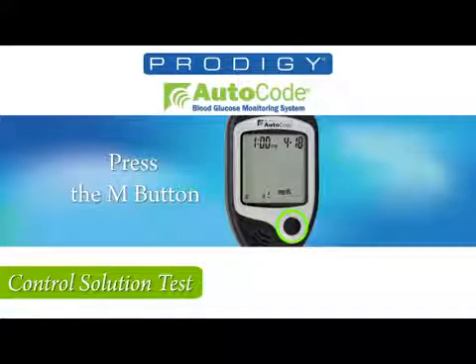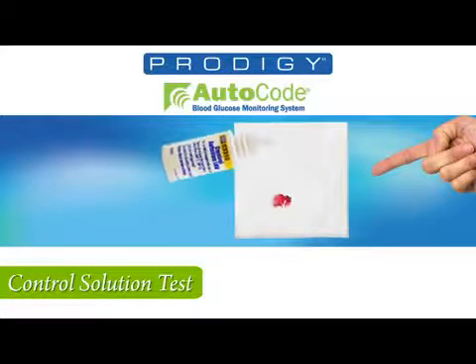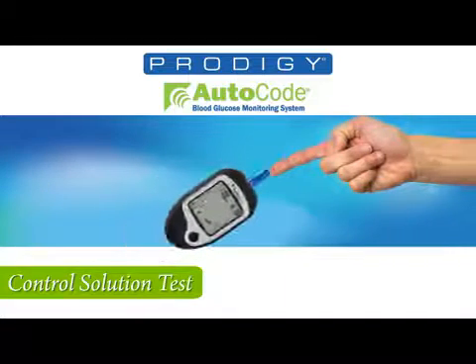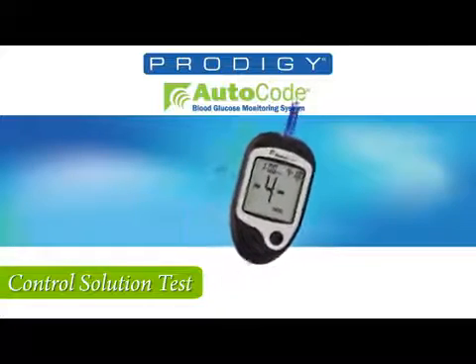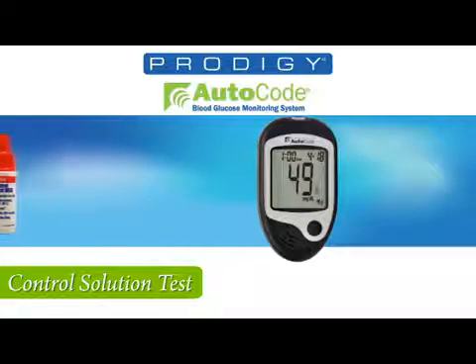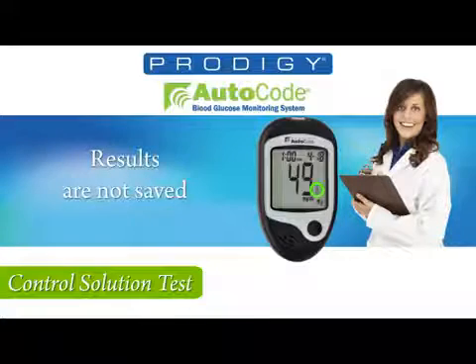Press the M button and the control solution mode will be entered. Now shake the bottle and discard the first drop on your tissue. The second drop is applied to your finger and then apply to the test strip. The meter will count down and report the test results. You can check the control solution ranges on your test strip file. Remember, in the control solution mode, the results are not saved.